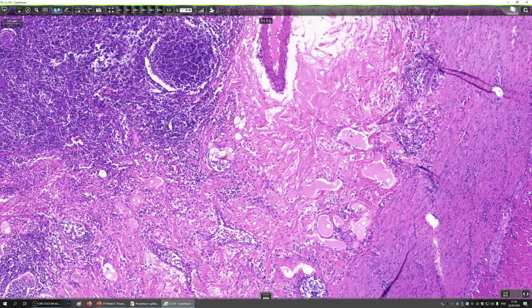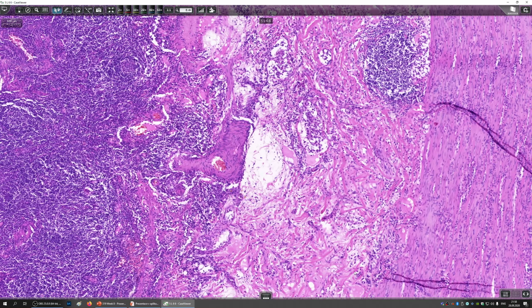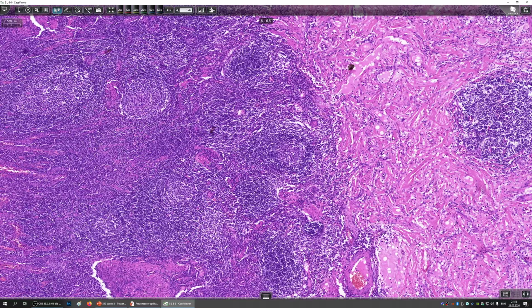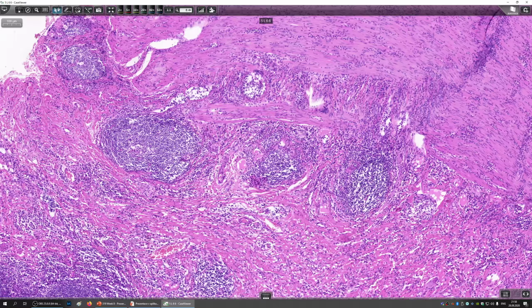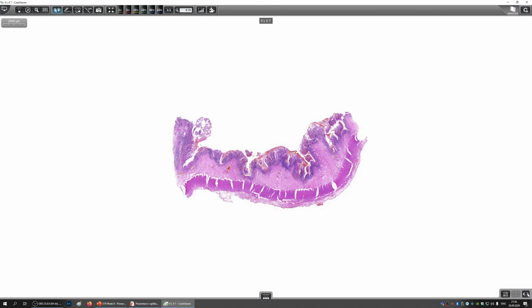And so far I'm not having luck with it, so I'm going to say this is a case where we don't have granulomas. I mean, their presence is not compulsory for the diagnosis of Crohn's disease, but it's a nice bonus when you have them, and unfortunately I don't see any. So this concludes the part on Crohn's disease, and let's get back to ulcerative colitis.